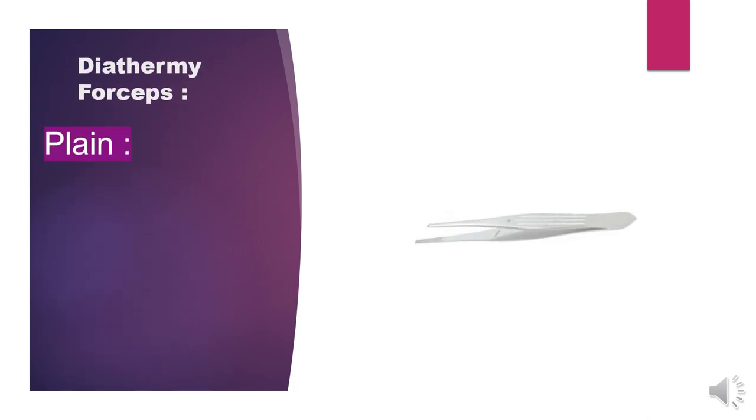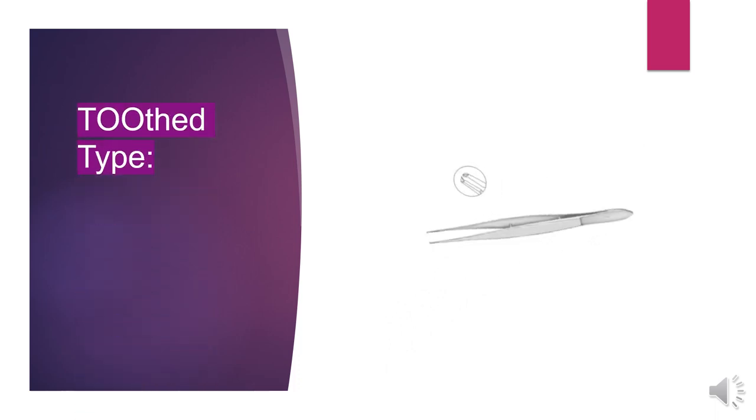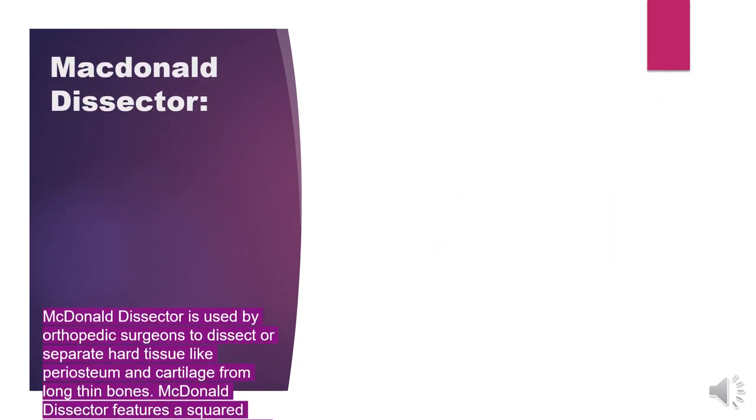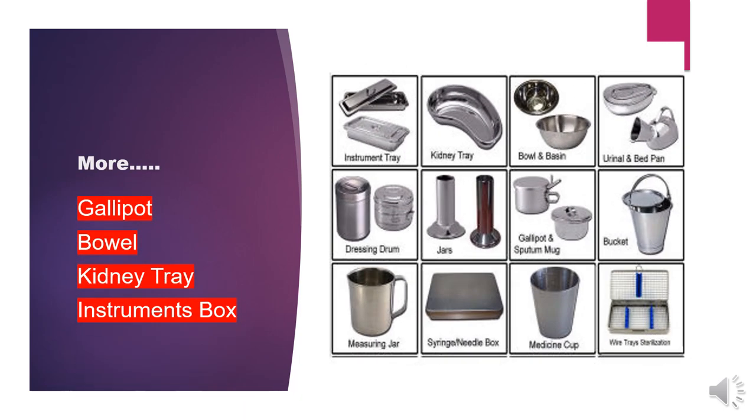Next we have diathermy forceps — both plain diathermy forceps and toothed diathermy forceps. These are also included in the general set instruments. Then there is the McDonald dissector, used by orthopedic surgeons to dissect or separate hard tissue like periosteum and cartilage from long thin bones. It features a squared handle with horizontal serrations for a convenient grip. It has a straight round blunt blade on one side and a curved round blunt blade on the other side. Additional instruments in the general set include gallipot, bowls, kidney tray, and instrument box.